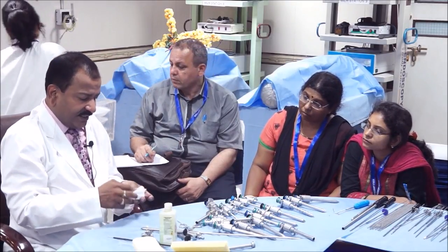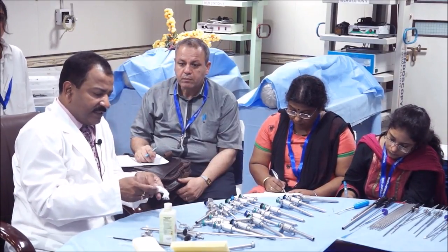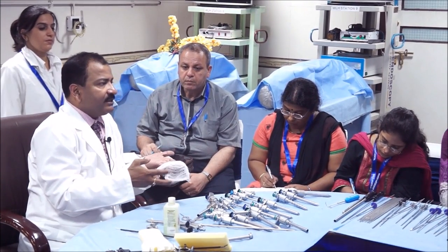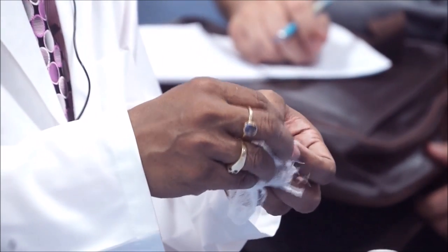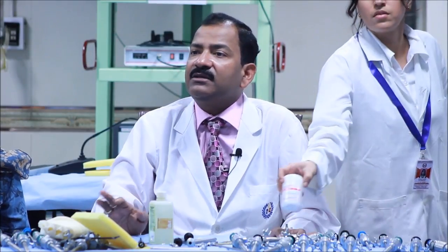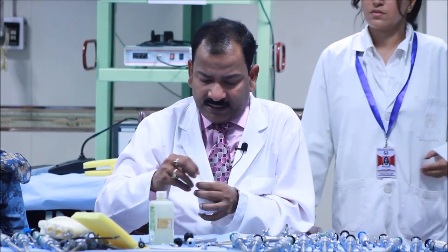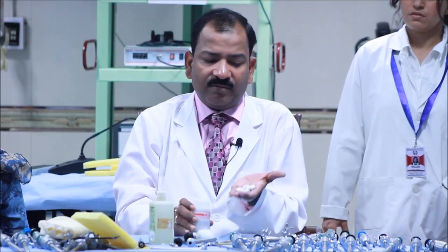These tablets, 6 tablets you have to put in a moist gauze piece, and it is only active till it is in tablet form. Right now it is tablet. Once it becomes powdered, that means it is expired. You have to use another. How frequently you have to change it depends upon how frequently you are opening. It also depends upon the ambient temperature. If it is winter, these tablets last for 2 weeks also. But if it is summer and your OT is not fully air conditioned, then it may be within 2-3 days, and if you are frequently opening, then the tablet becomes powder. The tablet comes like this, and then you will take it out, and inside these are the formalin tablets.